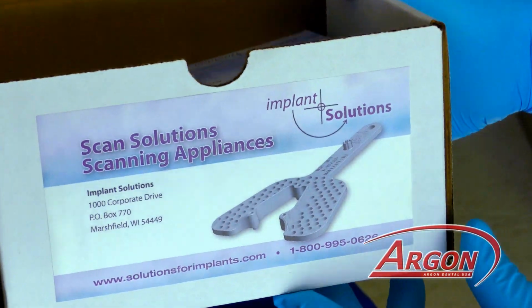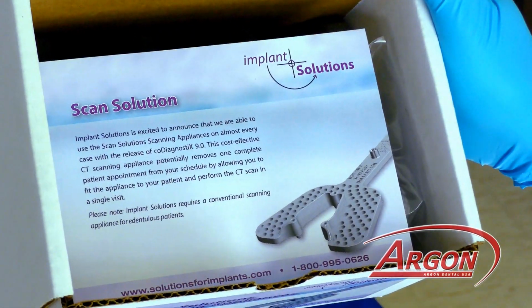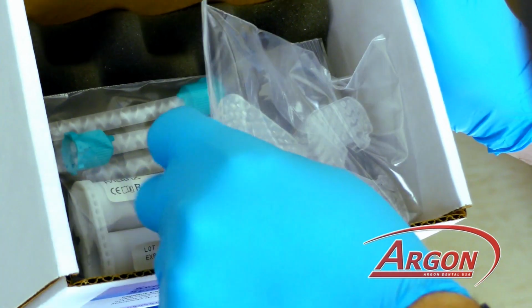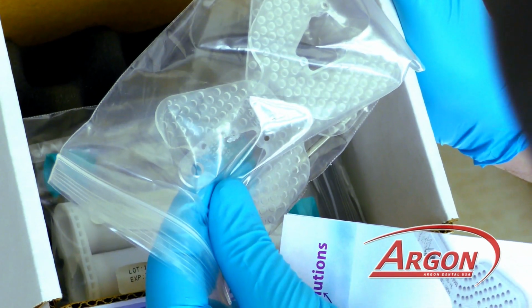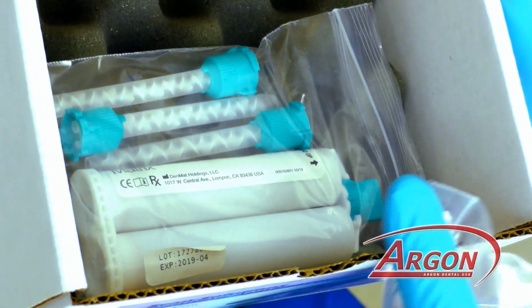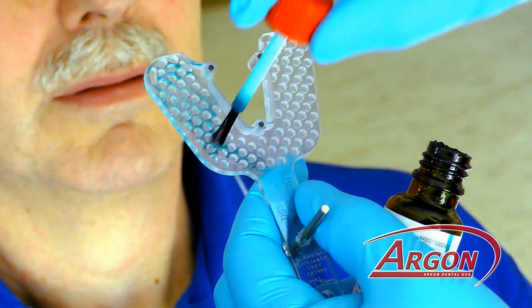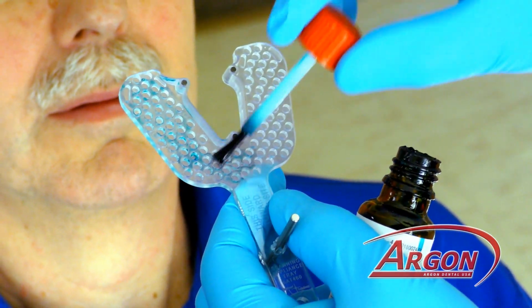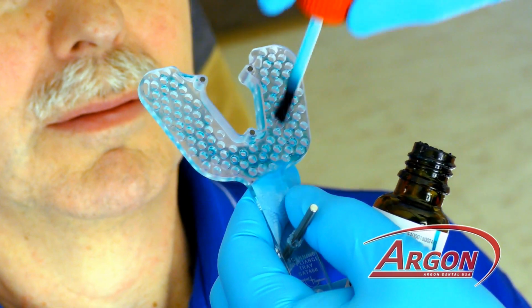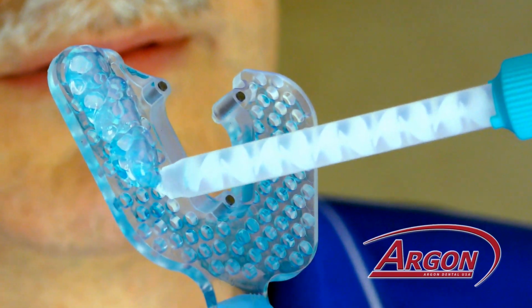A scan solutions guide is supplied by Implant Solutions. We only need this when we have an abundant amount of metal in the patient's mouth. They come in a pack of four. It includes clear bite registration material. Clear material must be used. Any standard bite registration material has a color pigment in it which blocks the CT scan. A clear bite registration does not have any of that opacity within the color pigments, therefore the CT scan does not show it.